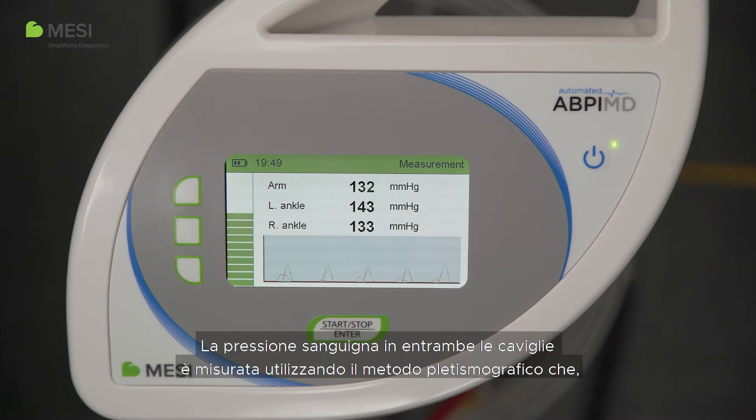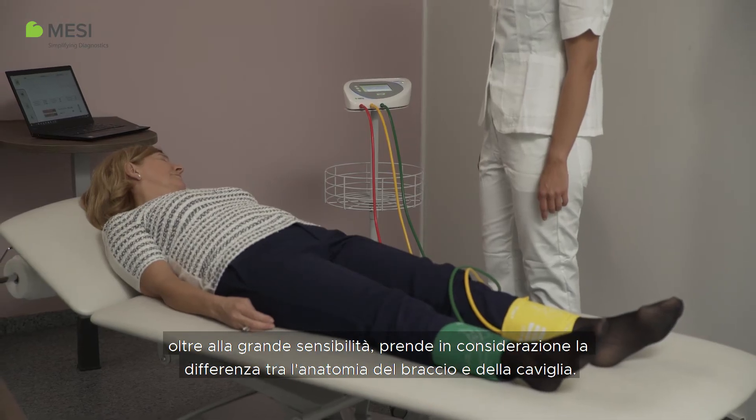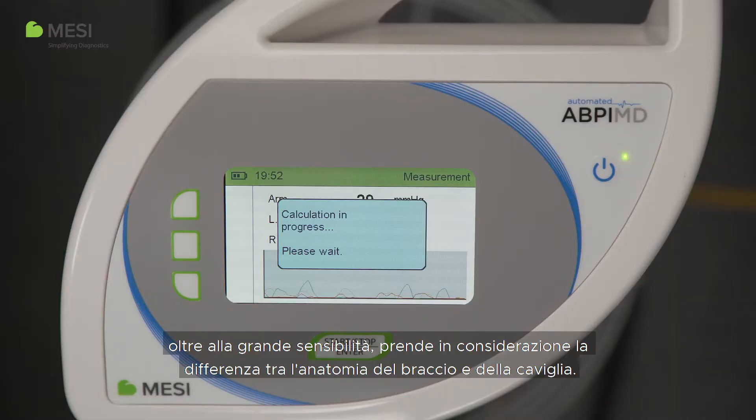The blood pressures in both ankles are measured using the plethysmography method which, in addition to its high sensitivity, takes the difference between arm and ankle anatomy into consideration.